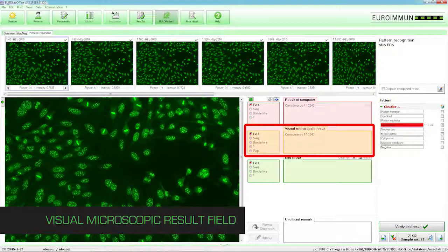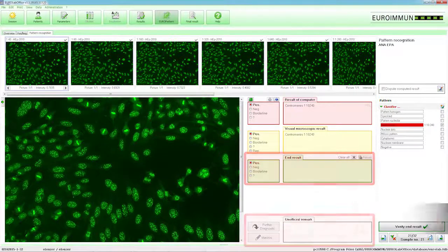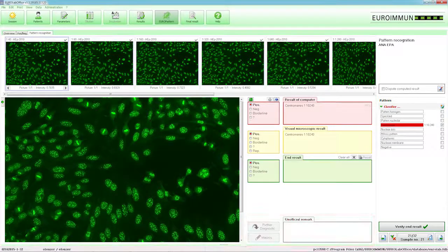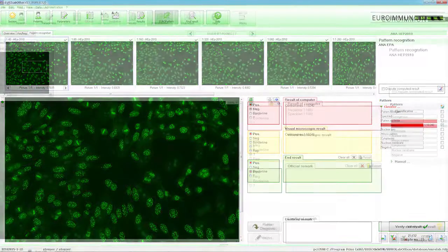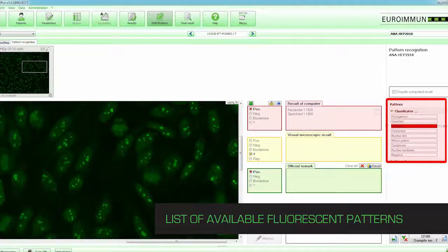The visual microscopic result field displays the result interpreted by the laboratory technologist. The end result field is populated upon verification by the laboratory technologist and displays the final results. The unofficial remark field is for internal comments only and does not get sent to the LIS system. These fields act as an audit trail between the Europattern, laboratory staff, and the LIS system. The automated result is also displayed in the list of available fluorescent patterns.